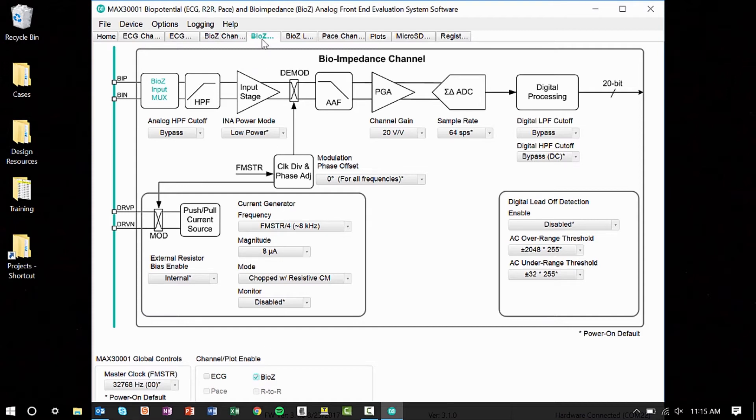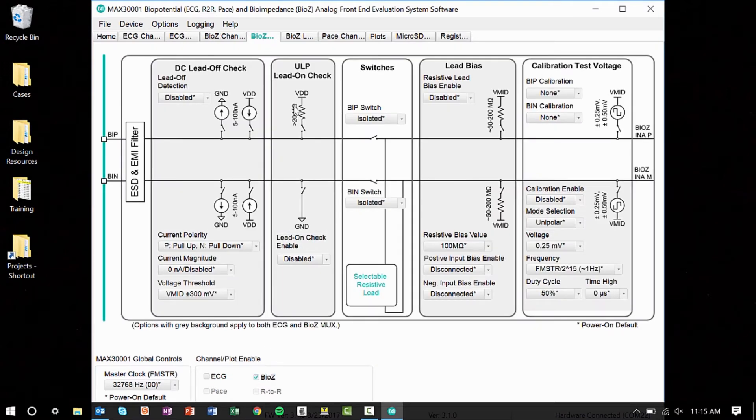Next open the BioZ MUX tab, which controls the internal signal connections. Set the switches to connected, the lead bias to the BioZ channel, the resistive bias value to 200 megaohms, and the positive and negative input biases to connected.